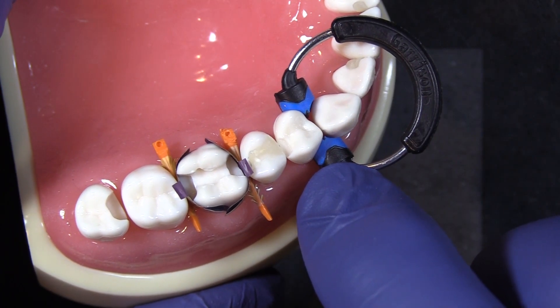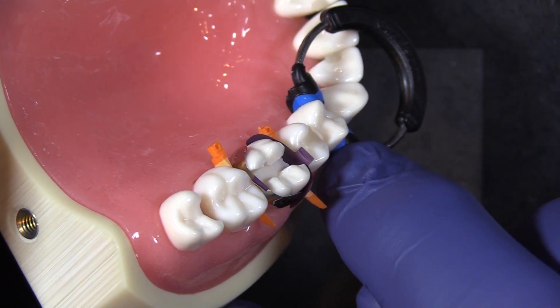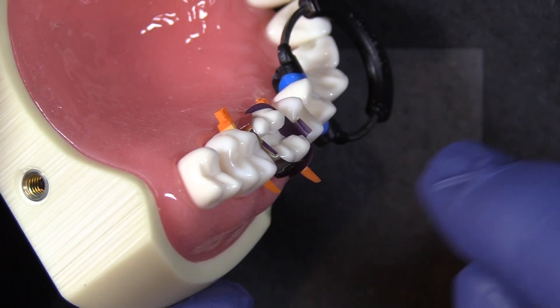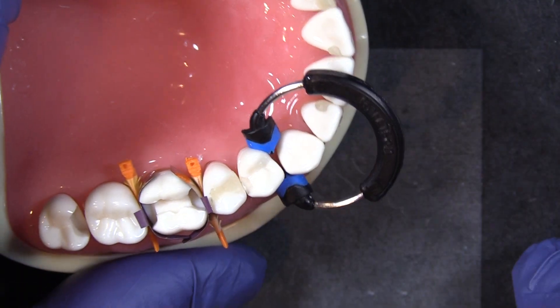This is a really good ring to use on primary teeth because those short little primary teeth have very little infra-bulge that's actually up above the gingiva. This can really help grip. There it is — the 3D XR.